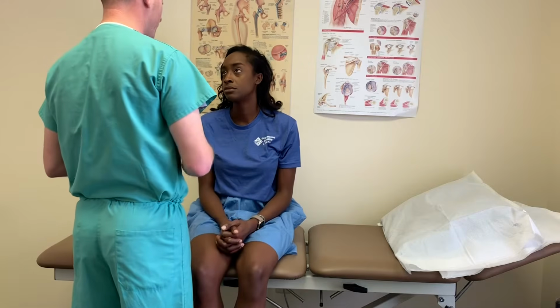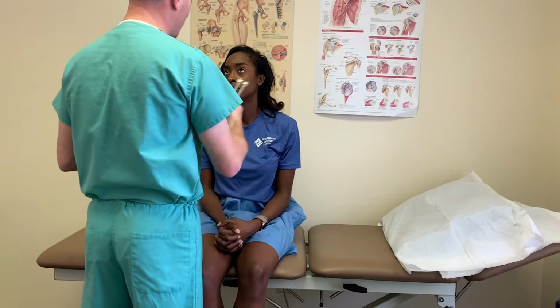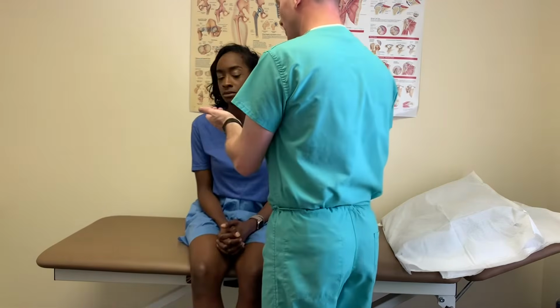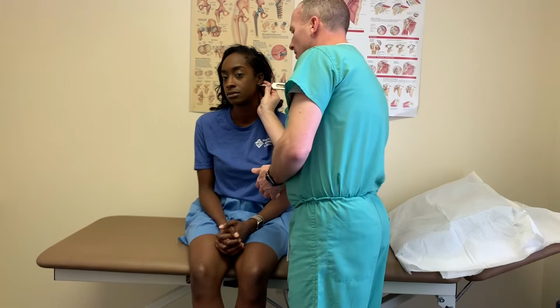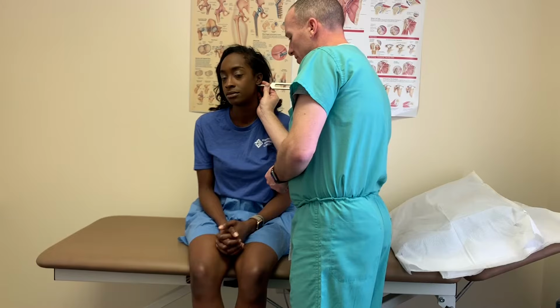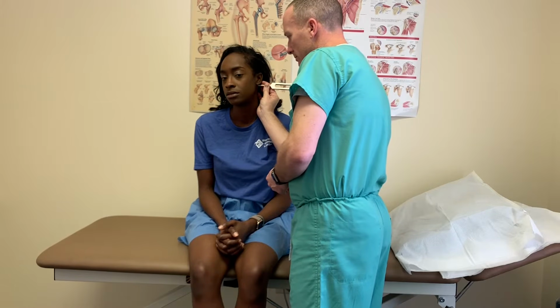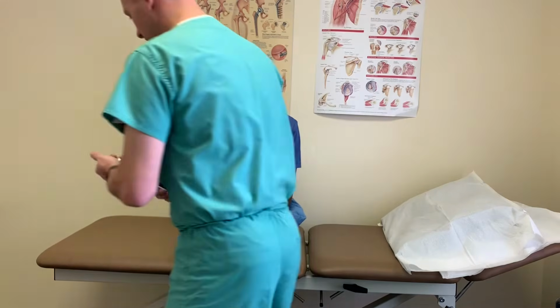However, if that was not the case, we could further deduce where the loss occurred and what type it is by doing the Rinne test. So what I would do then is strike the tuning fork. I would hold it back here on your mastoid process, and I would wait for you to tell me that you can no longer hear this. Tell me when you can no longer hear that. No longer hear it. Can you hear it now? Okay, very good.